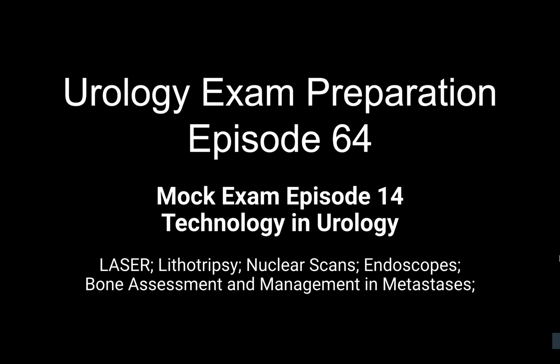Okay. So in a rigid cystoscope, for example, or a semi-rigid ureteroscope, the image is taken from the tip of the scope to your monitor and light is transmitted in the opposite direction. What is the difference between the light transmission and image transmission?